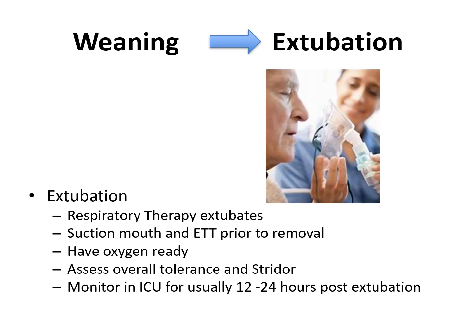So if they're ready to go from weaning to extubation, you want to emphasize that they are going to be breathing on their own and that we're going to be taking out the tube. And remember, the nurse does not usually extubate. Usually it's the respiratory therapist. You may work as a team to do it, but for the most part, the respiratory therapist will come and do it. You can be there because you want to monitor the patient as well. Stridor is the physical sign, a high-pitched wheeze, when you have an upper airway that's narrowed or obstructed. So that's one of the key things you want to monitor for.